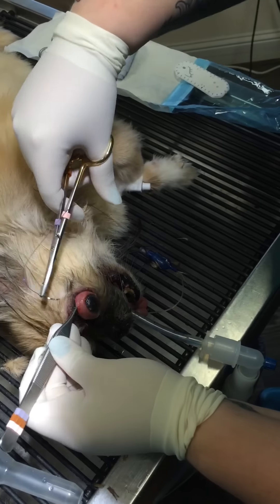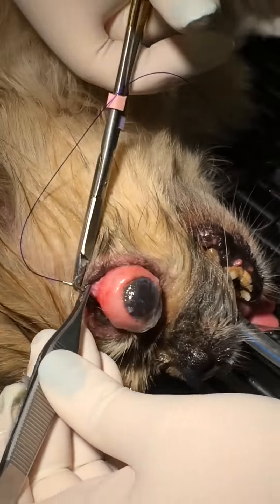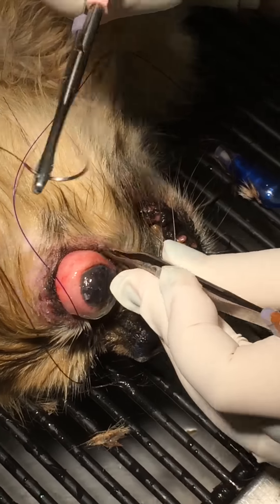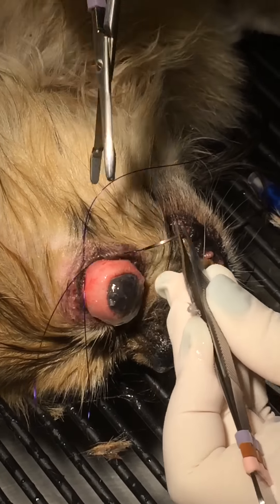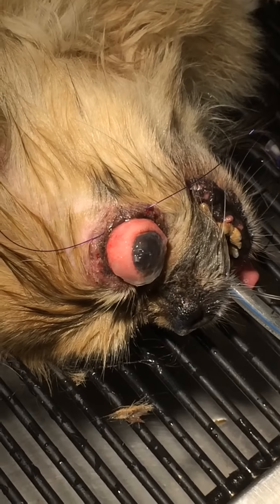So you find the eyelid. Grab that. That's not going to cry like that. That's very good. This baby dog.